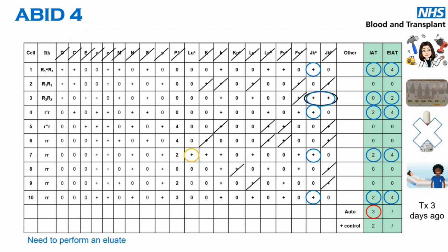So even though looking at the JKA, it's negative here, it's a heterozygous cell, so you can't exclude using that line. So you have to continue on till you get your next homozygous one, negative, that one's gone. I think for this one I've gone a bit mad and I've done them all. So you do only need one example, but sometimes it just feels nice to get shot of them all. So that's that one gone.